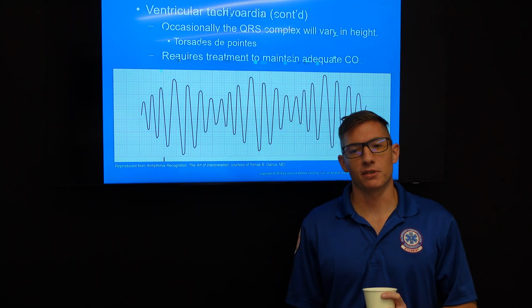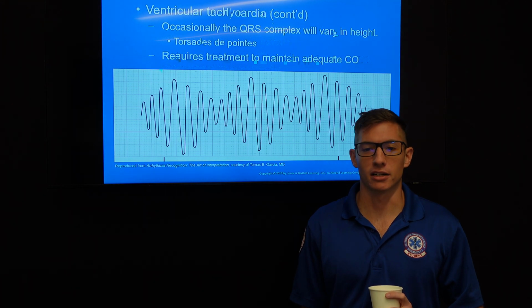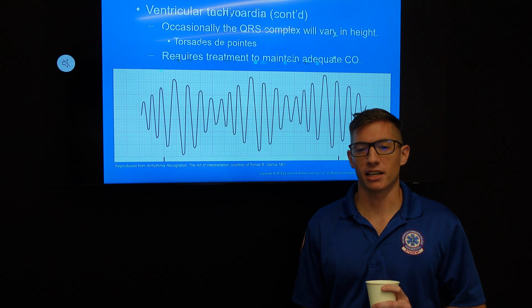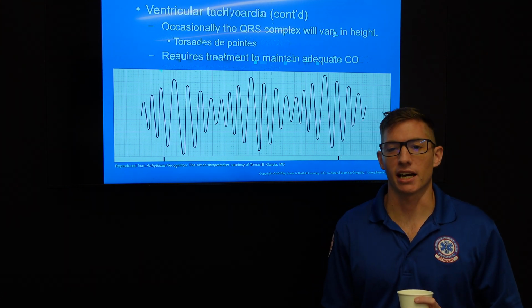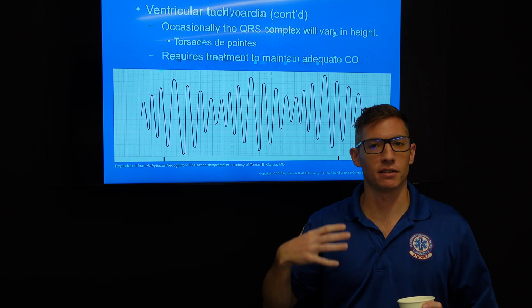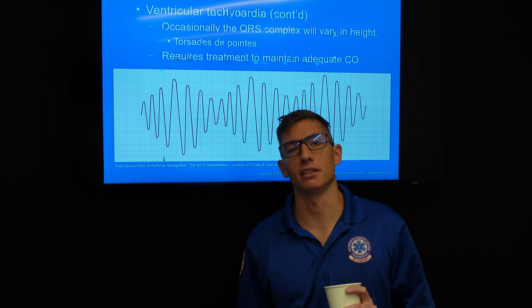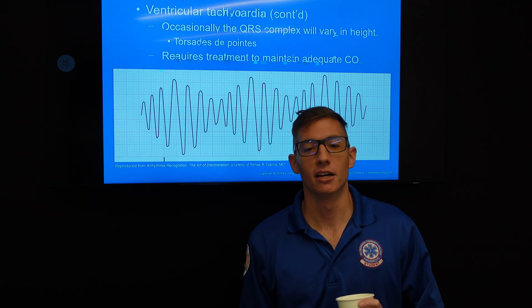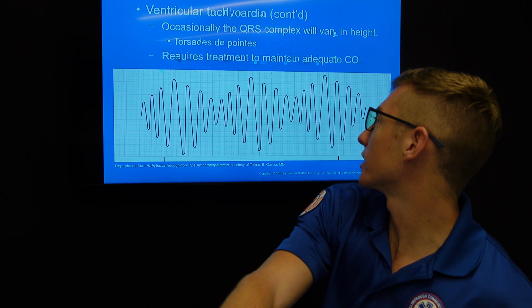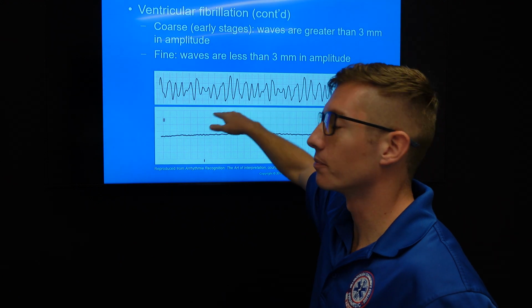If they're going into VFib, this is a rhythm in which the entire heart is fibrillating without a discernible pattern. It may happen when cells become depolarized independently rather than from the SA node impulse. So this is happening all around the heart, not just in AFib where it's just the top and the ventricles can catch it. Now the whole heart is basically fibrillating. No P waves, no PR intervals, no QRS complexes. It looks even less defined than that. This is VFib.